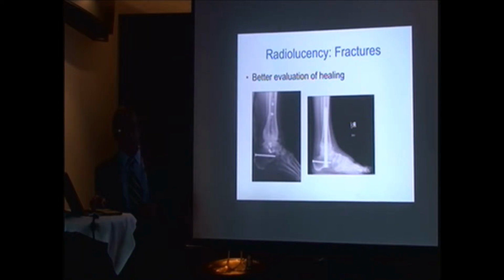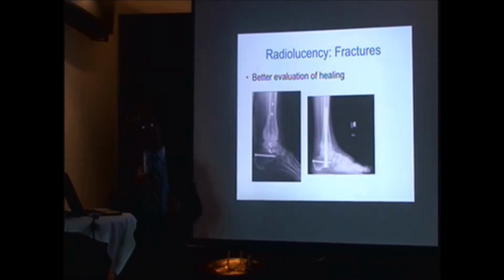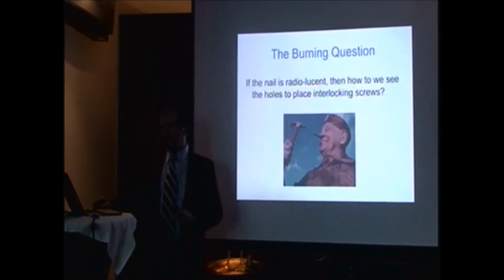You can also, as you saw before, see the x-rays. In the past, we couldn't see the x-rays because one of the tricks we would use in trauma, whenever you had a difficult case, is you would put more metal and cover up your mistakes. So the more metal you put, the x-ray wouldn't show what you had behind the metal, and this way you could get away and say, well, it's a difficult case. With carbon fiber, you cannot lie. So you can see everything. So you better do a good job when you do the initial fixation. And obviously, the oncologists love this because now they can monitor their treatment, they can radiate, they can do MRIs, they can do CT scans, and you saw the effects of that.